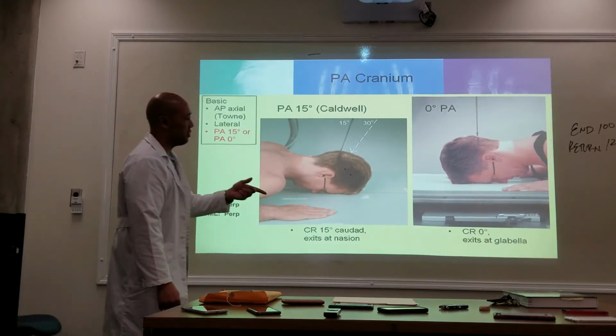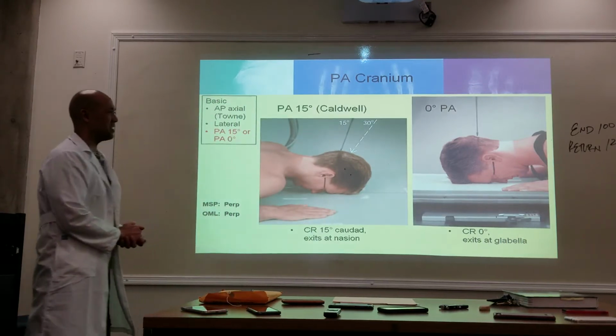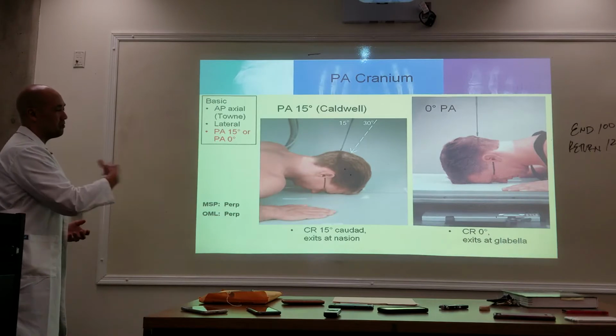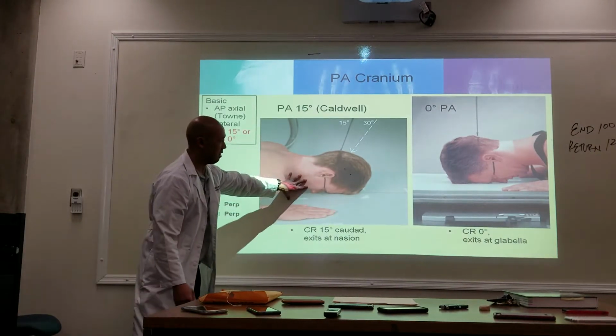There's also an optional view here, which is center ray 0 degrees, which now exits the glabella. They are both used for different reasons. The most common projection position is the PA Caldwell.